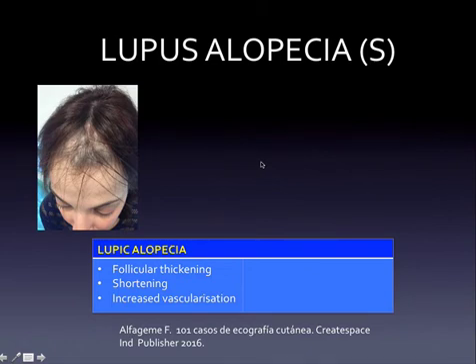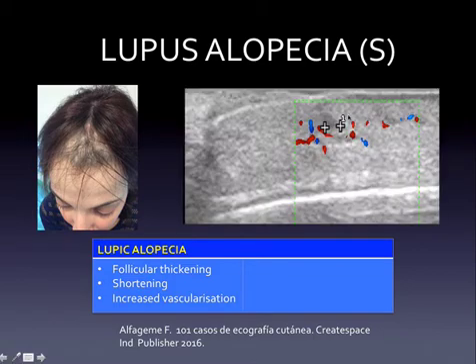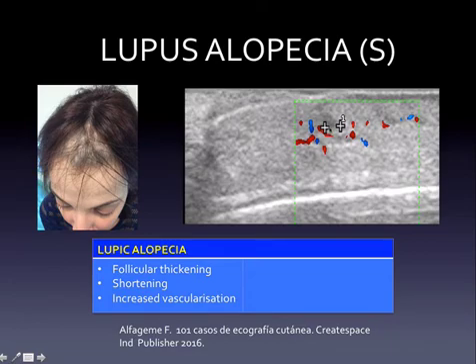Some immunological diseases such as lupus tend to produce this kind of scarring alopecia. We see follicle thickening with shortening and increased vascularization — this is very typical of lupus alopecia. Some immunological or collagen diseases present with this kind of follicle involvement.